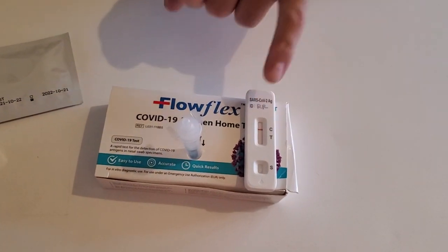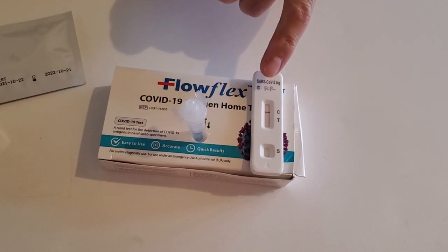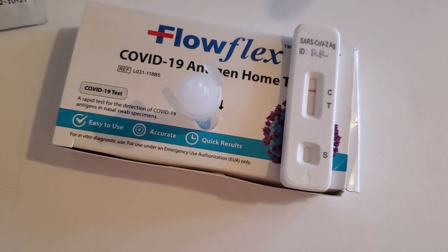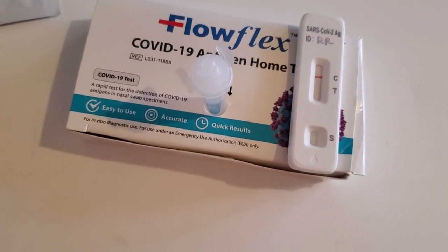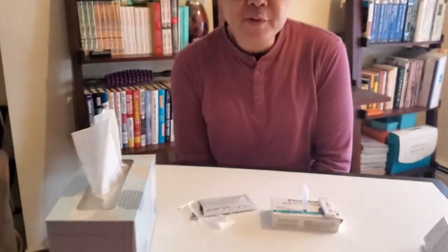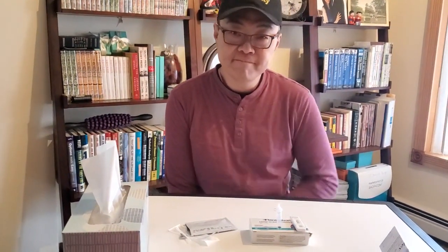You can see that it's one line, and basically that tells you it's negative. If there's even a faint line at the T side or a solid line, then it's positive. It looks like I'm negative — I'm good to go for the holiday party! Merry Christmas everybody from a crazy, crazy COVID year. Hope everybody's safe and have a wonderful holiday. Take care.